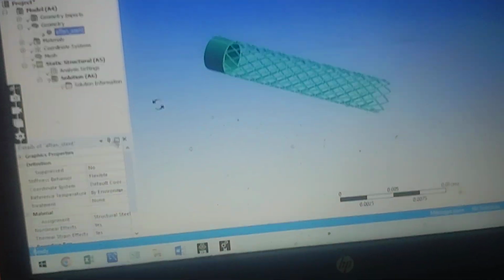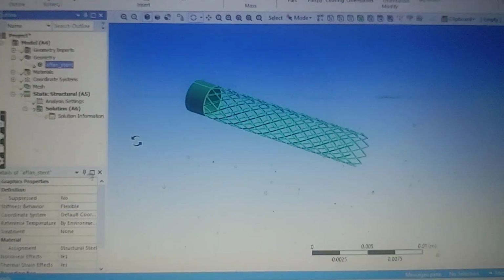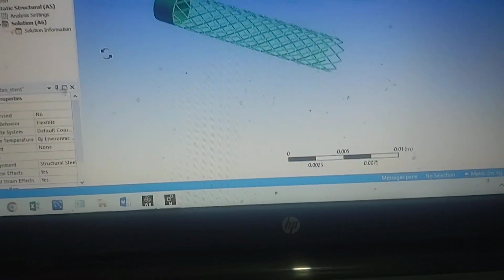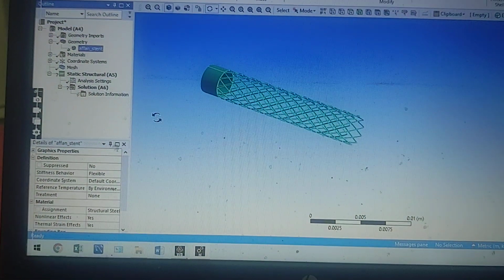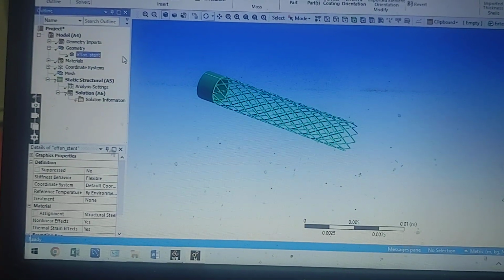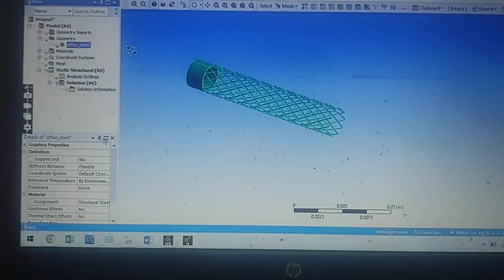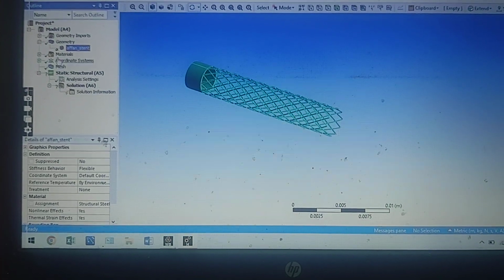Hello and assalamu alaikum. In this video, I am going to discuss the stent simulation in ANSYS Workbench 2020 R1, meaning release 1. This is a basic simulation of a cardiovascular stent that is being placed in a human artery with plaque, if it is affected by heart attack or any other disease, mainly heart attack.